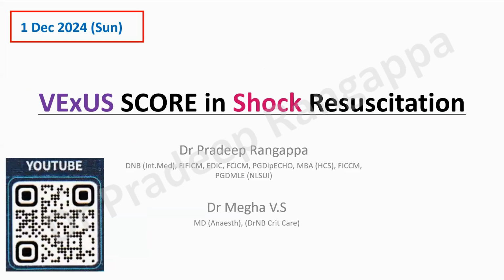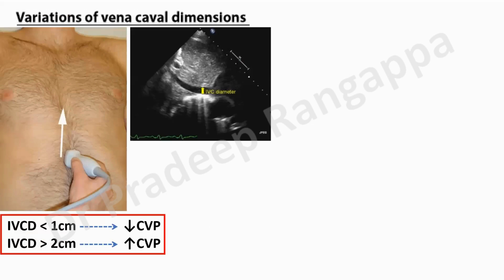So, hello friends. I'll be talking on this VExUS score in shock resuscitation. If you recall, I had given an overview of VExUS in a previous video, maybe one year back. This talk is similar, but we will talk on the utility, how VExUS can be utilized in resuscitating shock by citing two examples. Then we'll talk about what the limitations of VExUS are and what the take-home messages are. I wish to acknowledge my colleague, Dr. Megha, who helped me develop this content.